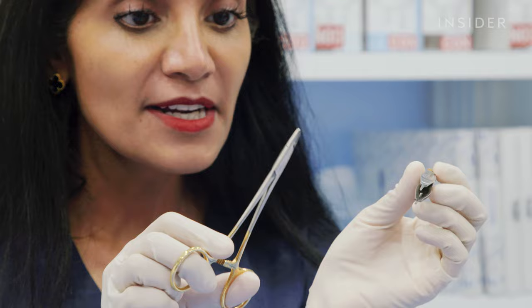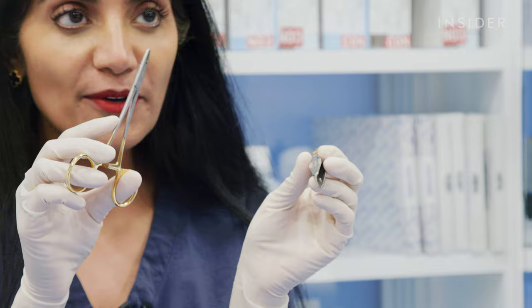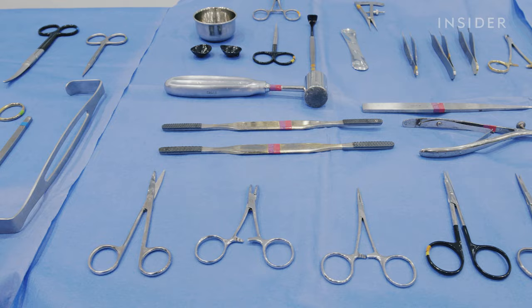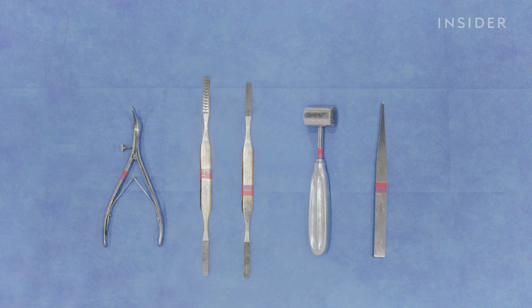And these are the instruments that I use to handle a needle and suture when I'm sewing closed the incision line for an upper and lower eyelid blepharoplasty surgery. You may have noticed this interesting collection of instruments right in the center of the table. And these are some of the instruments that I frequently use for rhinoplasty surgery. And I will start by using the nasal speculum.